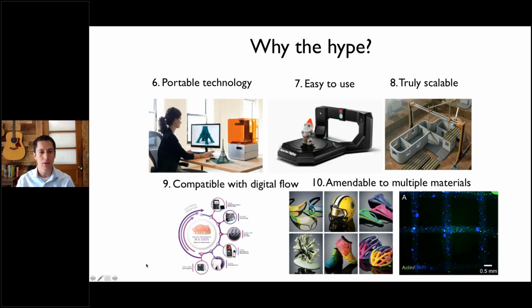It's a very portable technology nowadays. You can have it essentially at chair side, very easy to use. You don't even need to know CAD anymore to be able to build 3-dimensional parts in the computer. You can actually just scan, as Kurt just showed. You can scan a part, send it to the printer, and off you go.